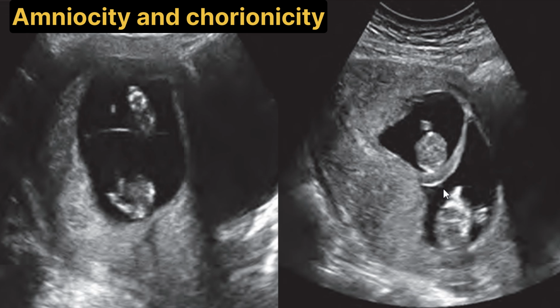This is the longitudinal transabdominal image of the gravid uterus in the patient during the first trimester. It shows the twins that are separated by the thick dividing membrane, and it is consistent with the dichorionic diamniotic twinning. The amnionicity and the chorionicity should be documented when multiple gestations are imaged during the first trimester because the membrane thickness is reliable for assigning the chorionicity early in the pregnancy, but it is less reliable later in the pregnancy.